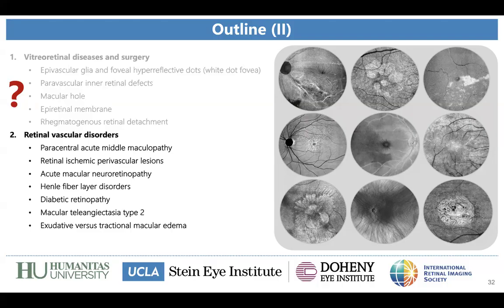Thanks to en face OCT and this large view with a single acquisition, we can visualize the pattern of not only the closure type and subtype, but also the presence of photoreceptor disruption and granular hyperreflective dots. There is a paper by Govetto and colleagues on this in the American Journal, but also the presence of CME around the full thickness macular hole. So for sure, the application of en face OCT in macular holes is very, very important.